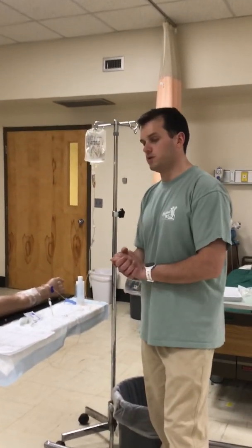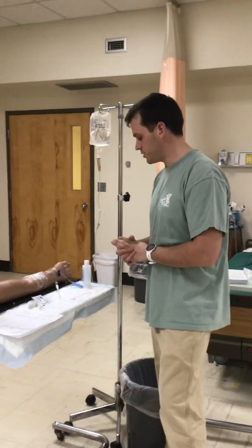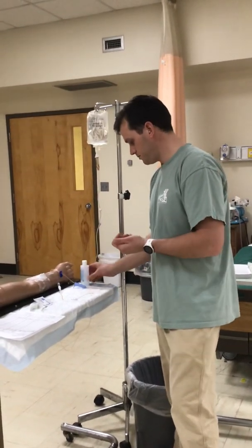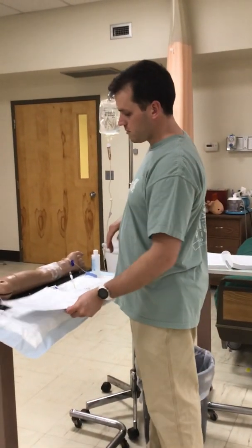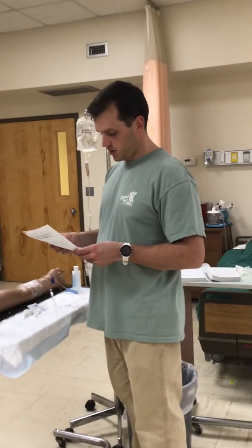And this will be the 3rd time I've checked to make sure that I have the correct patient for the correct medication. I am once again going to perform hand hygiene. I'm going to ask Ms. Green if she has any allergies that might conflict with this medication. She says she's allergic to penicillin, which does not conflict with furosemide.